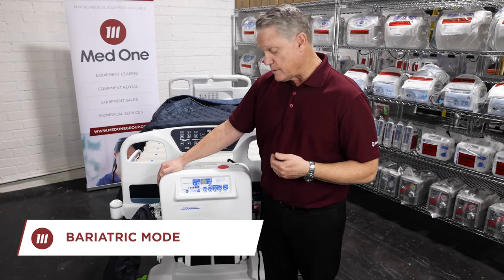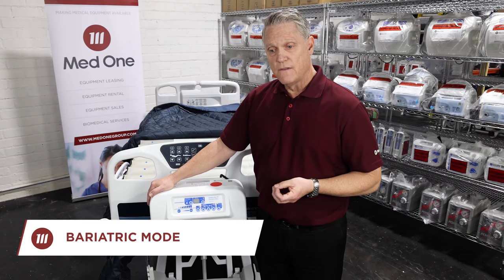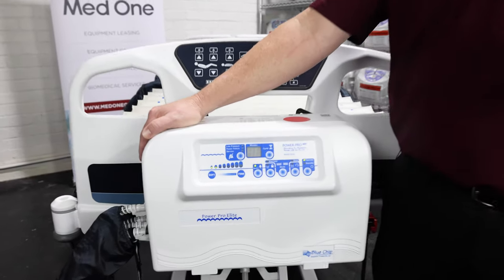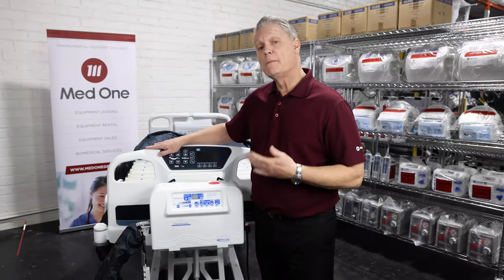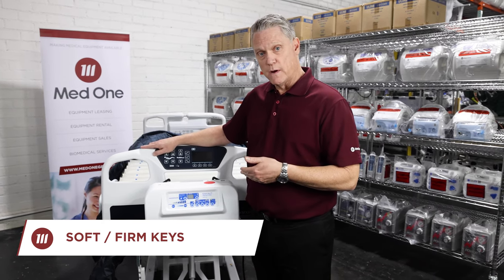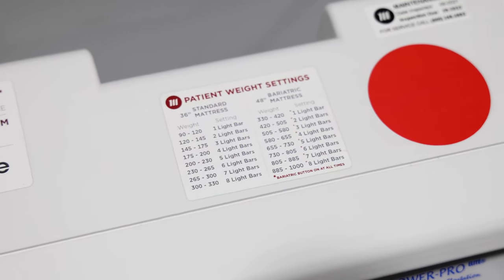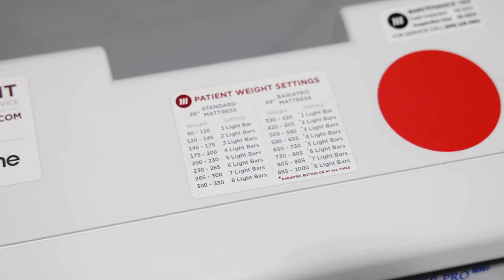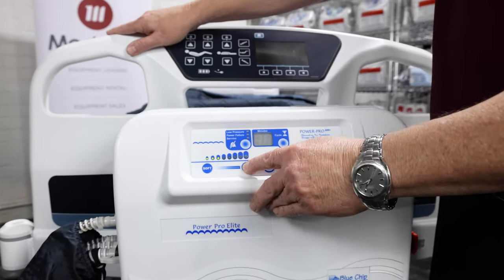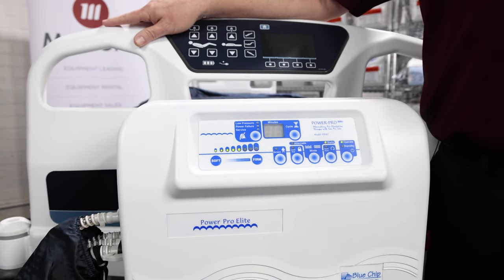Next to the lockout feature is our bariatric button. Our bariatric button is for someone who wants a little bit of a firmer mattress. Simply push this button, the light will come on and this will make it a firmer mattress for your patient for comfort. Next to the bariatric button are our soft and firm keys. You will need to set the pressures in the mattress to the patient's weight. MedOne has provided a weight patient setting sticker on the top. Match your patient's weight within that range to the number of lights listed, then simply adjust the soft and firm keys to achieve the number of lights you need. Once you've adjusted them, there's no need to make another adjustment unless there's a dramatic weight loss or weight gain.